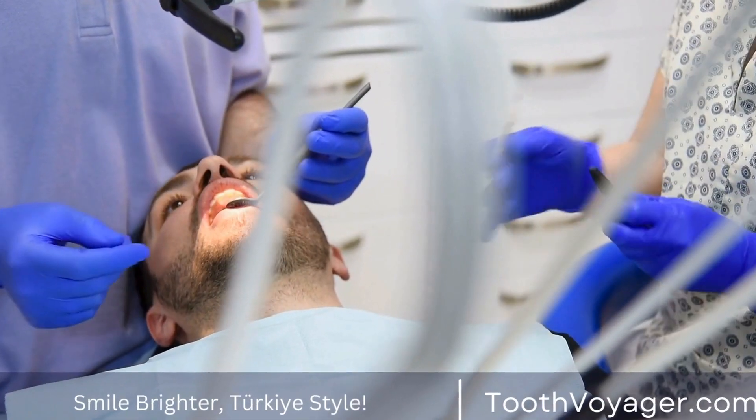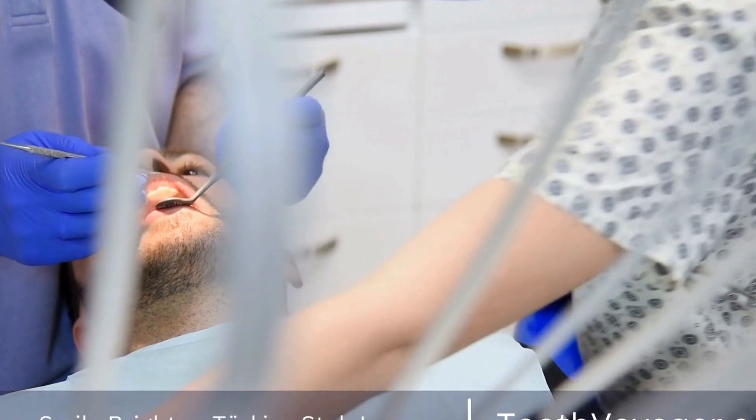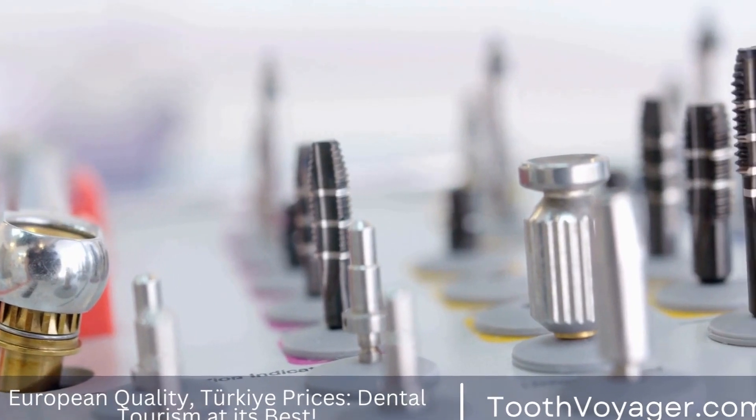Composite resin crowns are made from a tooth-colored material that can be easily shaped and molded to match the natural tooth structure. They are less expensive than other materials, but may not be as durable.